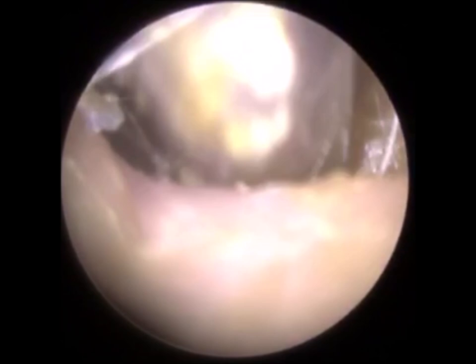And I'm probably going to go in with the forceps in a moment. As I've loosened this a bit and created a little tail end, there's something for me to grip onto. Let's see if I've gone in with the forceps. Yeah, there we are. So again, I'm just trying to get a grip, and you'll see here how much I am pulling at this, but it just doesn't want to come. It's just tearing into little pieces.